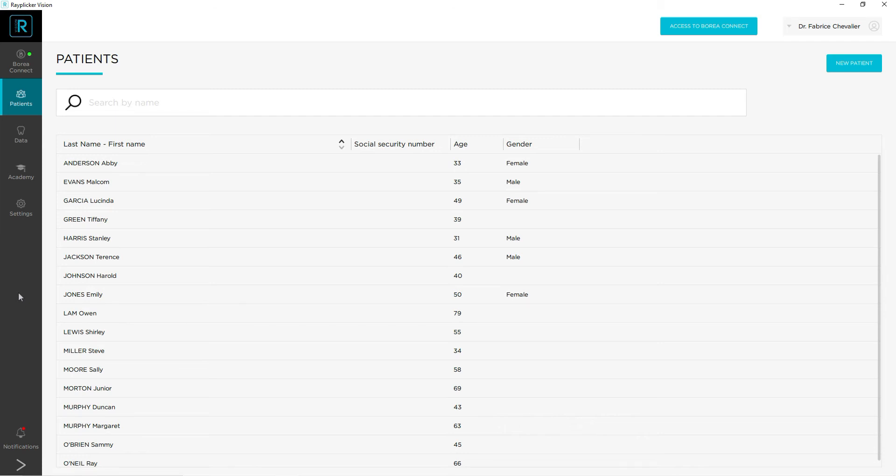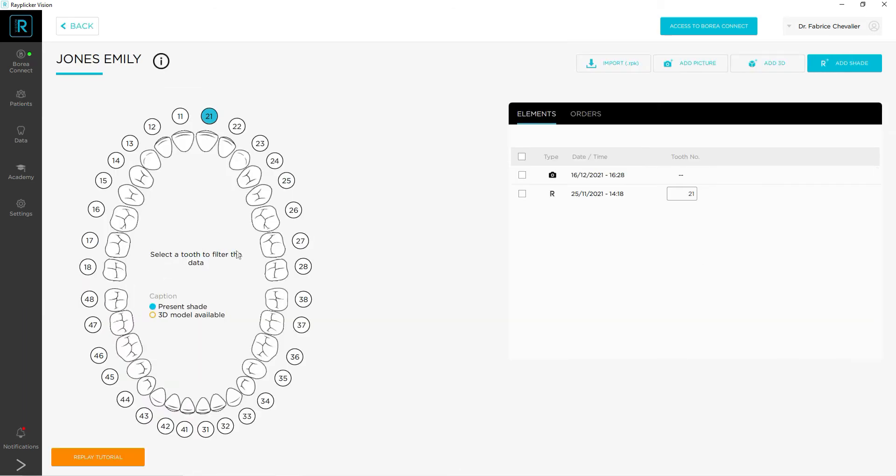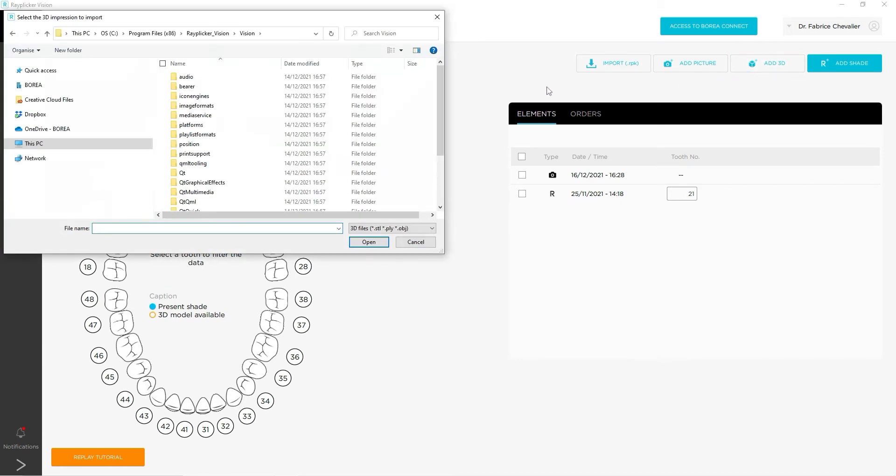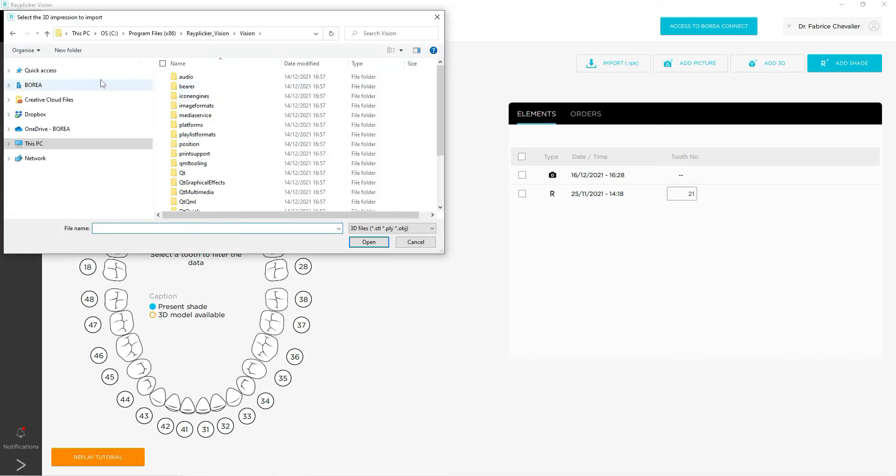To import a 3D file into your Replica Vision software, simply click on your patient's name and then go on Add 3D button. Then select the folder where your 3D file is located and double click on it.